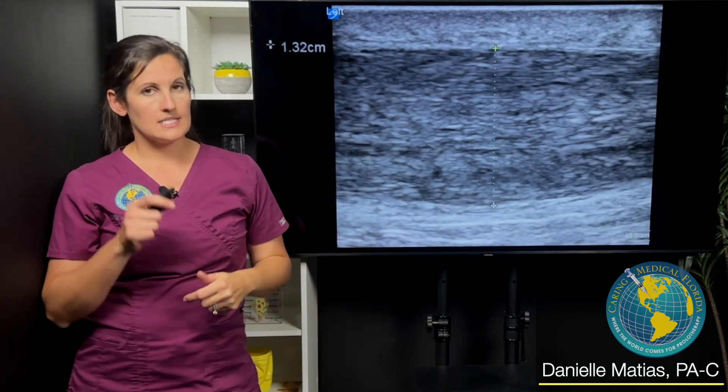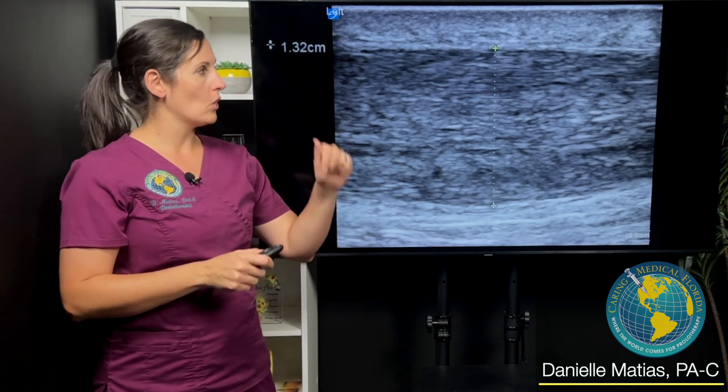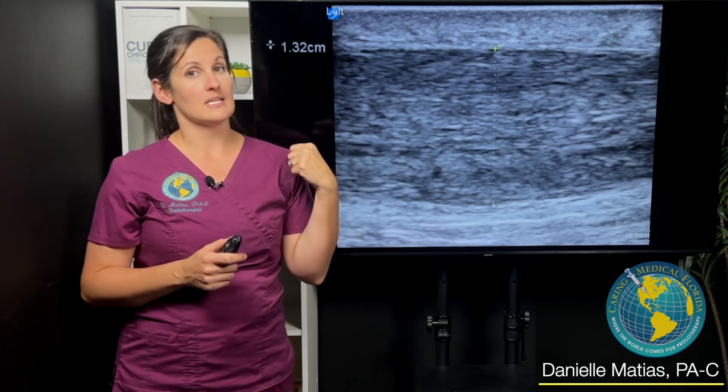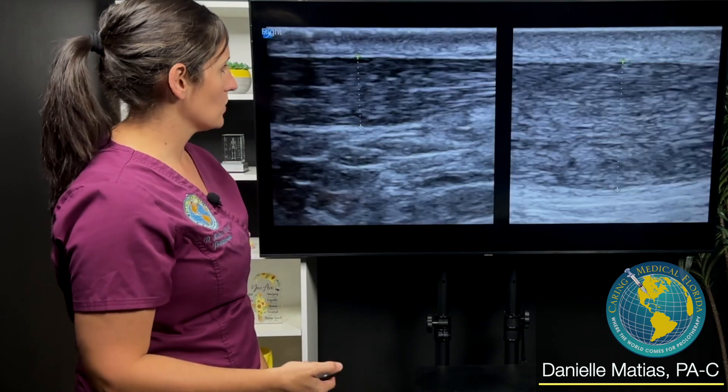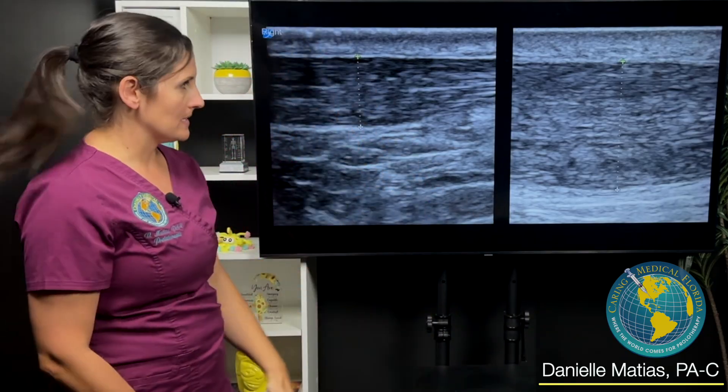What's important to note is that the more degenerated the tendon is, the thicker it's going to be — bigger is not always better. This is pretty much almost twice the size of his good side; that's how degenerated this tendon is. Even just comparing side by side, you can tell a clear difference between the good and the bad even if you didn't know anything about this patient.